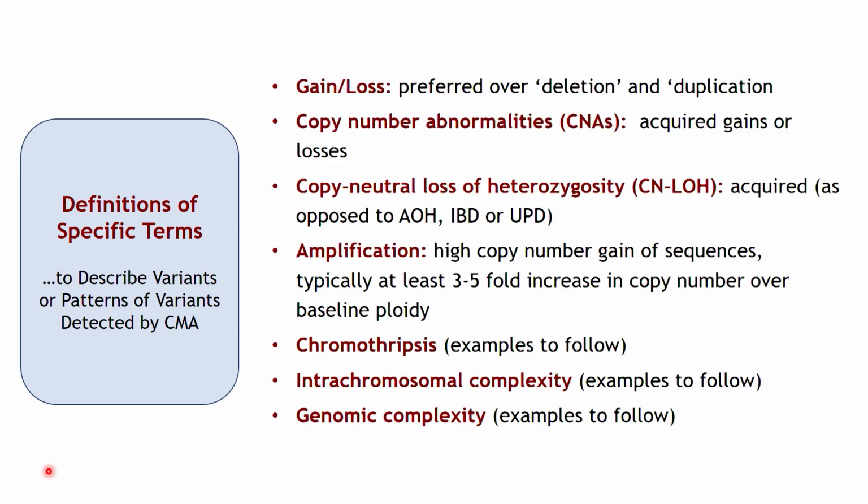So moving on to the next component of these standards, I mentioned that we provide definitions of commonly used specific terms. So here is a list of some of the terms that we define in this manuscript in order to improve consistency between laboratories in how we use all these different definitions.